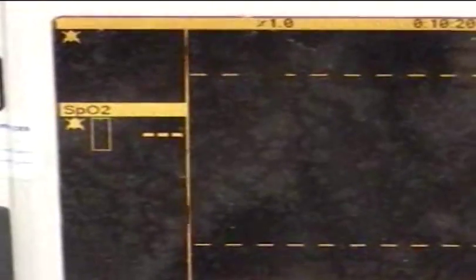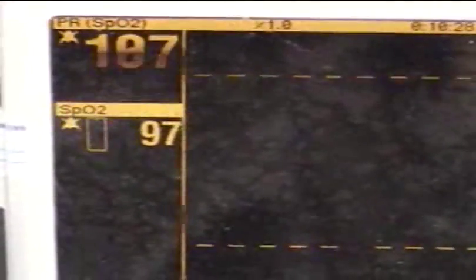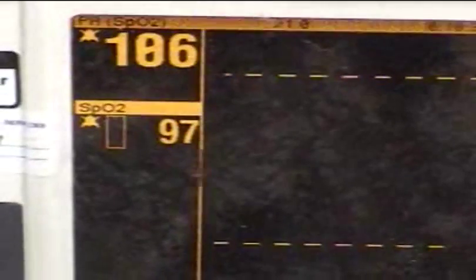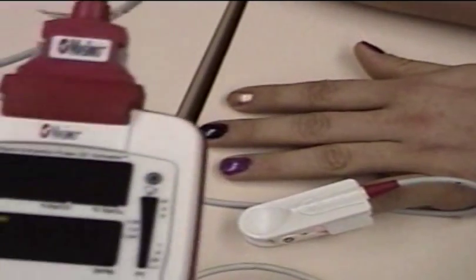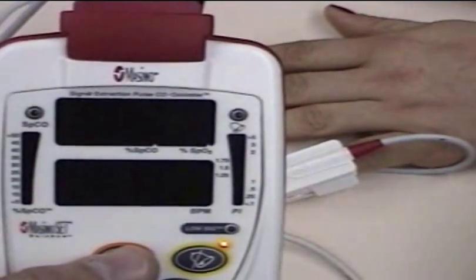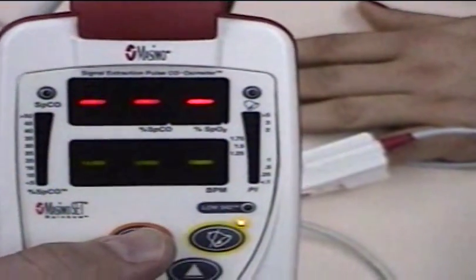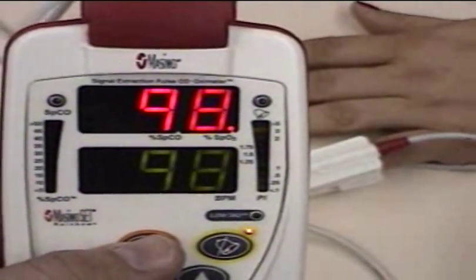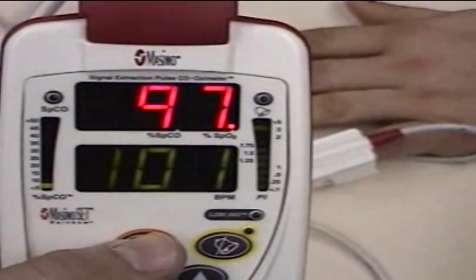Then we got red — a red color going on the thumb. 97%. The heart rate's still over 100 because he's a smoker. When was your last cigarette? Right before I came in — about half an hour, an hour ago. Pulse ox is at 97%, CO is at 3.